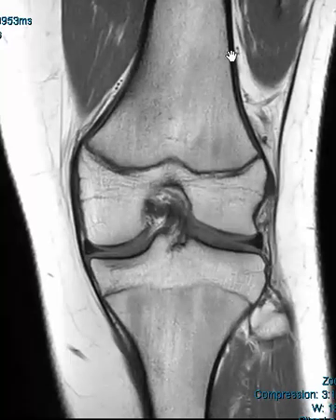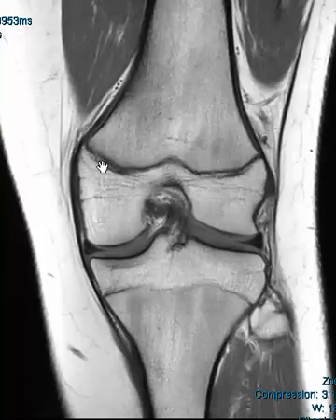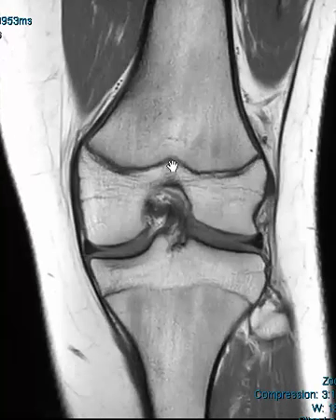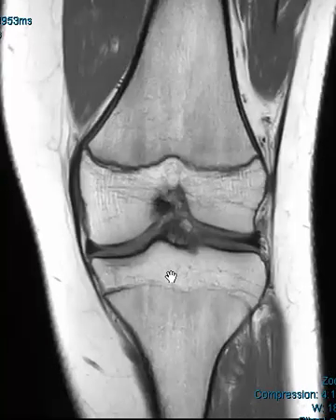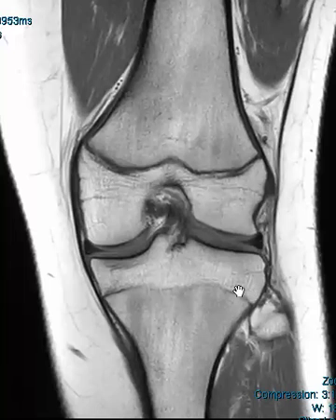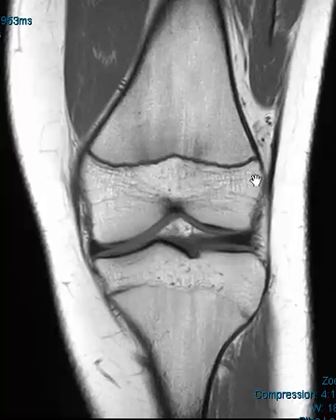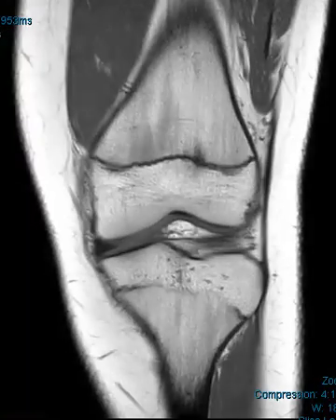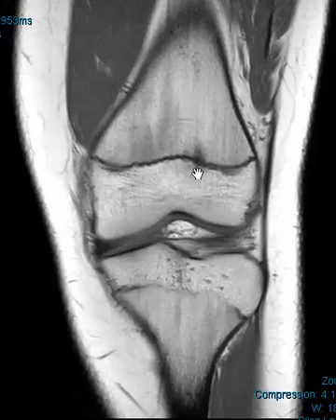This is a coronal T1-weighted sequence. We see the femur coming down and the femoral growth plate coming across here — it's not fused yet. We note down here that the tibia does have fusion of the physis, so this is already fused. We know this is going to happen soon, and as we roll forward we do see an area of low signal right here.